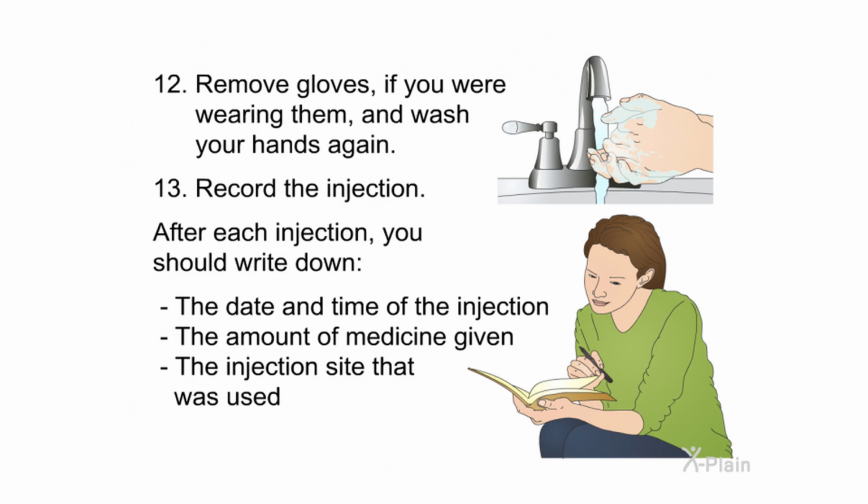12. Remove gloves if you are wearing them and wash your hands again. 13. Record the injection. After each injection, you should write down the date and time of the injection, the amount of medicine given, and the injection site that was used.